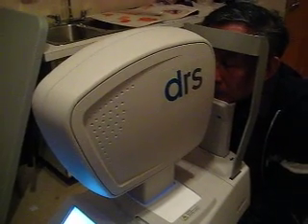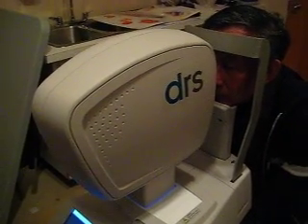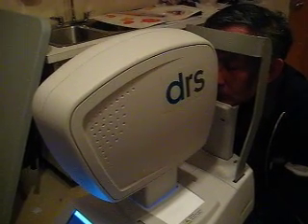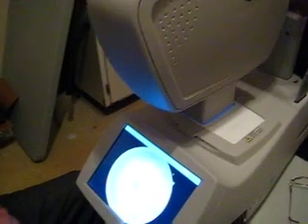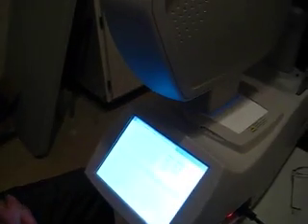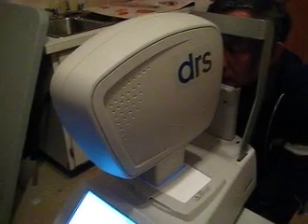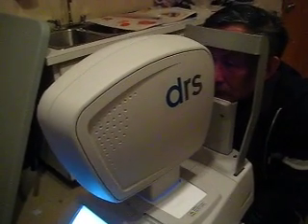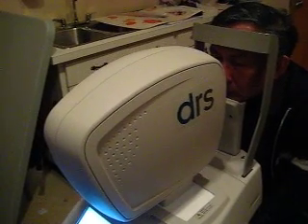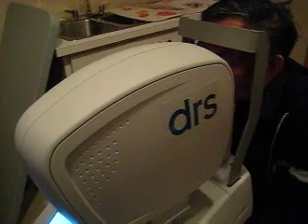If you would, you can close your eyes for 15 seconds. The camera is going to reset itself so that it's going to find your other eye in two seconds — in fact, one second. So we're going to start to go through this process again. You're going to hear the whirring of the motor. The camera is going to be seeking the center of your eye. And we're searching right now. It's coming in. Perfect. Absolutely perfect.